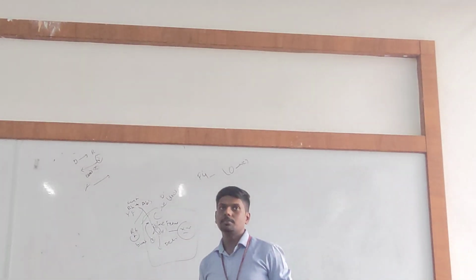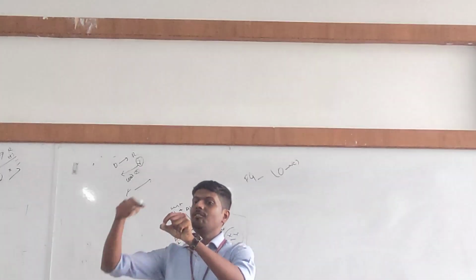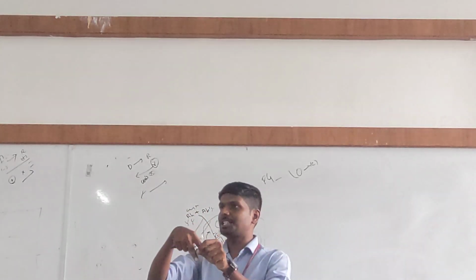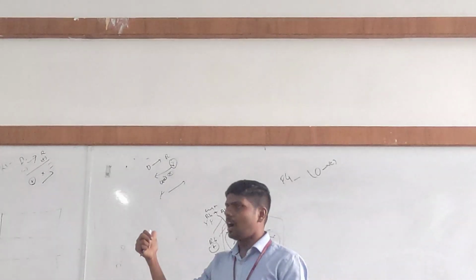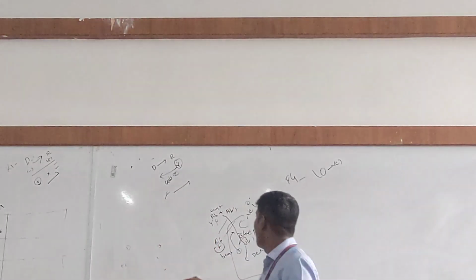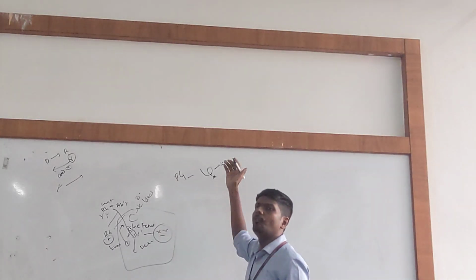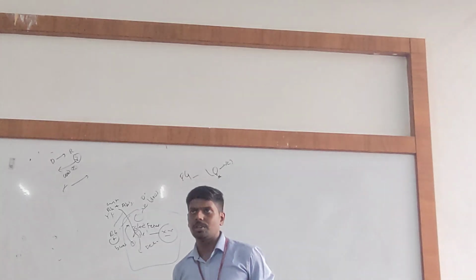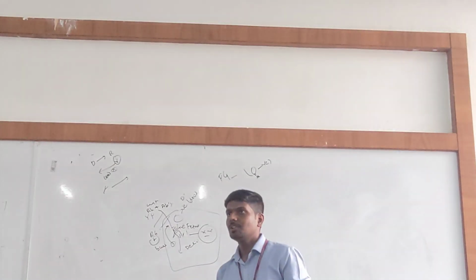That is true actually. Because we only took her blood, her red blood cells, and we are checking her red blood cell antigen. Since we didn't get any antigen, we assume she is a negative group, O group. RH antigen also not present. So we assume she is a negative individual, O negative individual. Is the concept clear?